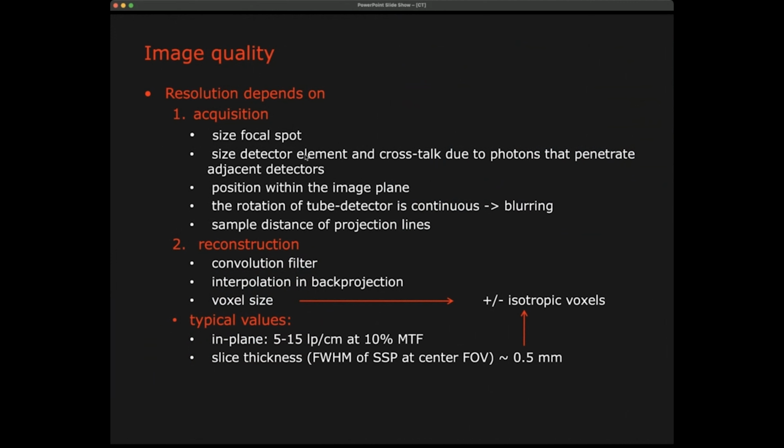Do I have a big integrating detector? Do I have a small detector? And detectors that are next to each other, can they discriminate well? Are these detectors positioned ideally with regard to the beam? And do we know this, or is this wiggling, for example? Also the rotation, is the rotation done properly? The mechanics around this. All these things are related to the scanner in some way.